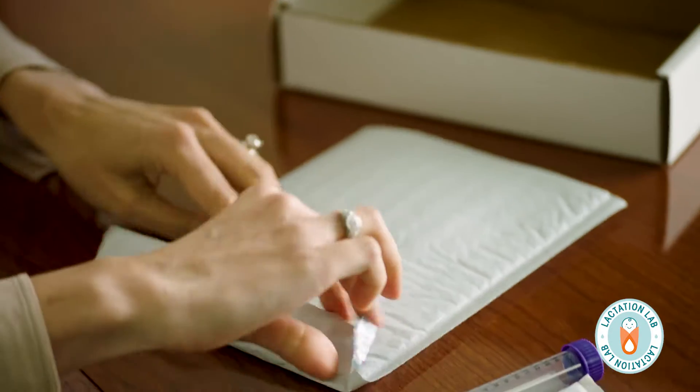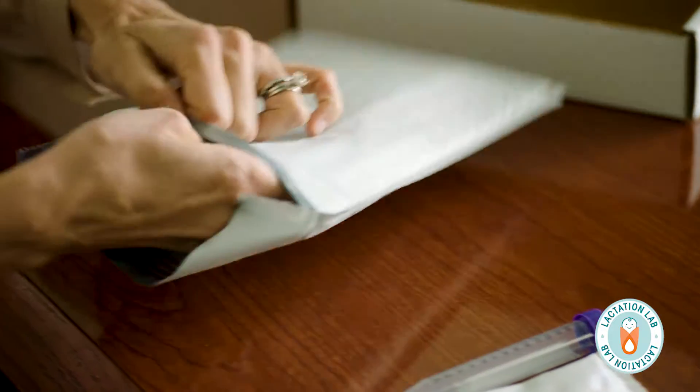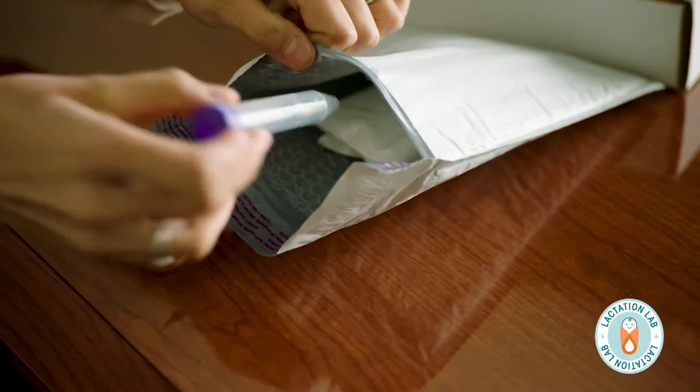And then you'll also receive a return envelope where you'll place the frozen gel packs and the container filled with milk and mail it back to us. I just want to make an important note that it does not matter if the milk thaws. It is not for consumption — it is for testing only.